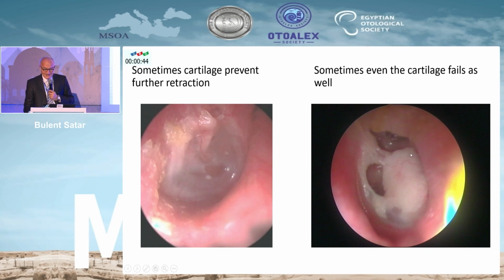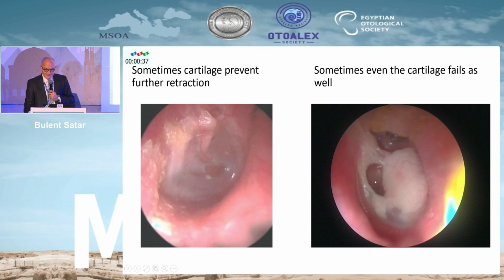Sometimes fail to protect the ear. You can see the gradual retraction of the cartilage.